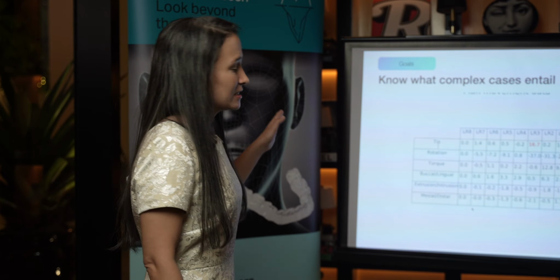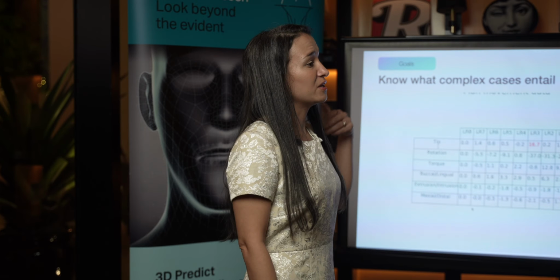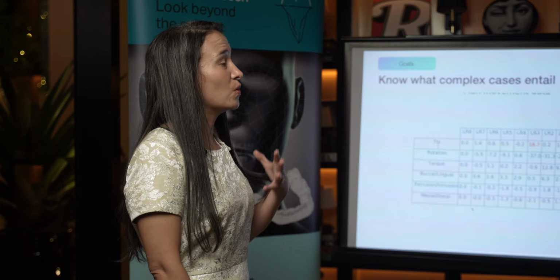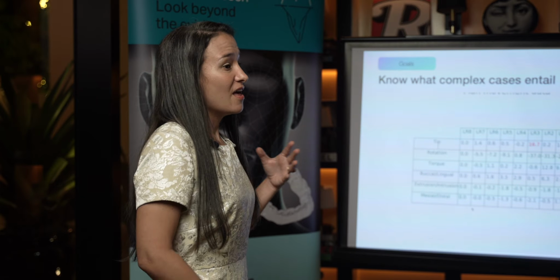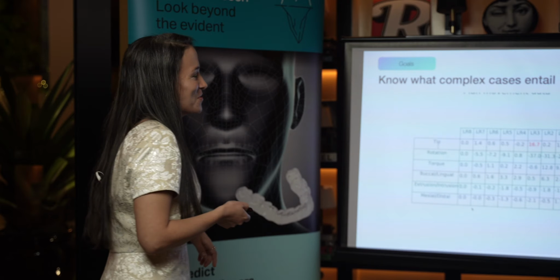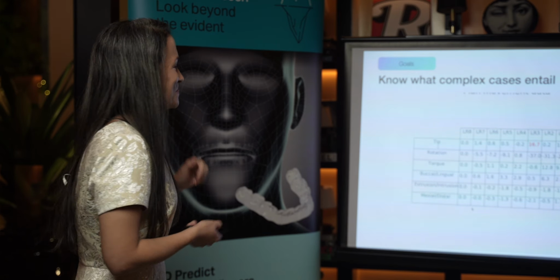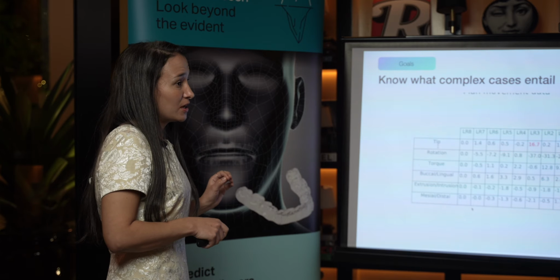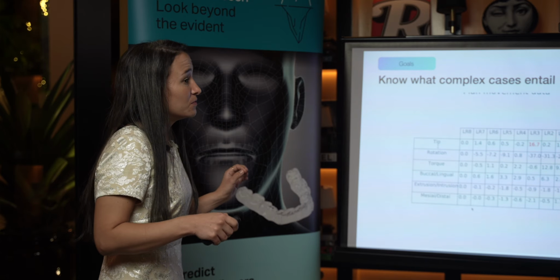But this case, because it was complex, because the patient didn't want extraction, because the doctor didn't even want to do IPR, right? Yeah, your face, I know. Then once again, we're not magical. Then this is what we could give the doctor. And we had to tell the doctor, is this achievable?